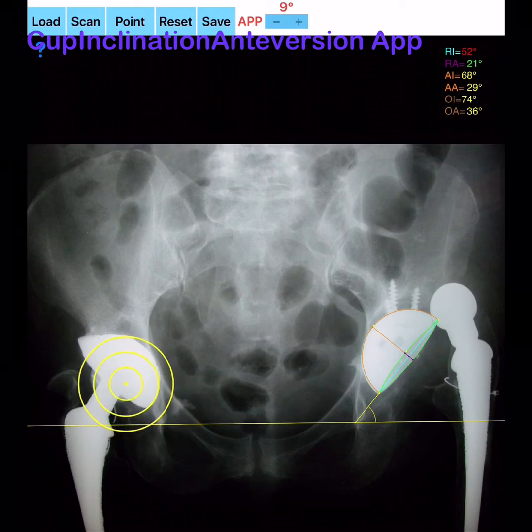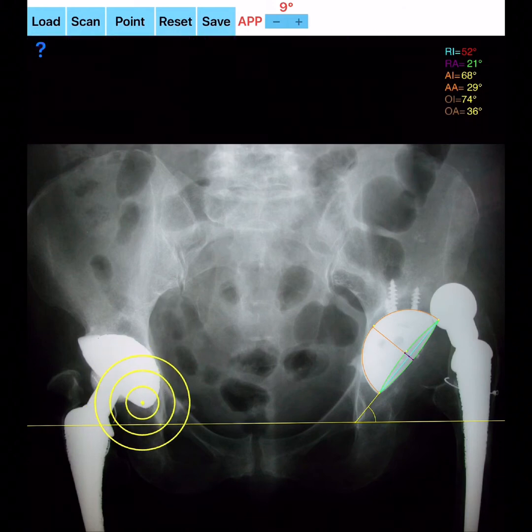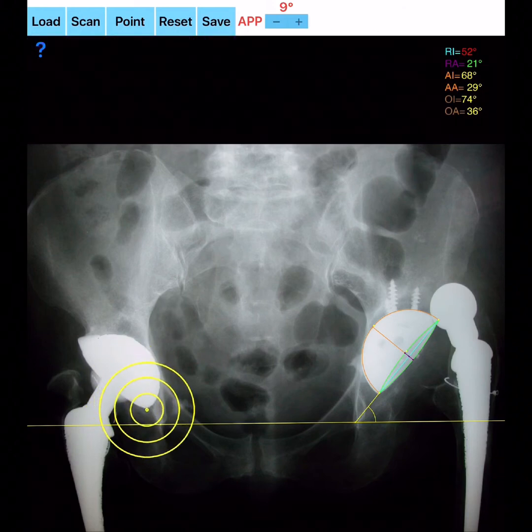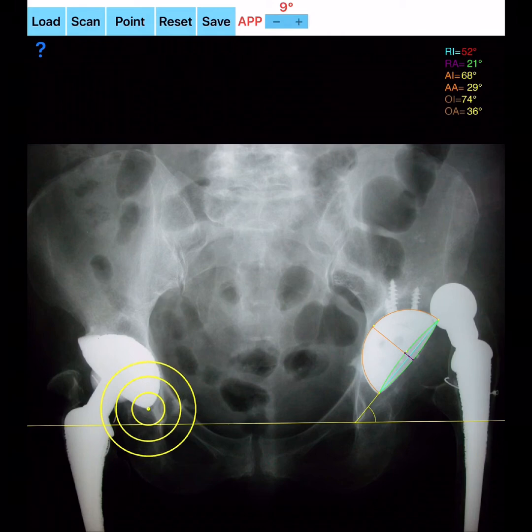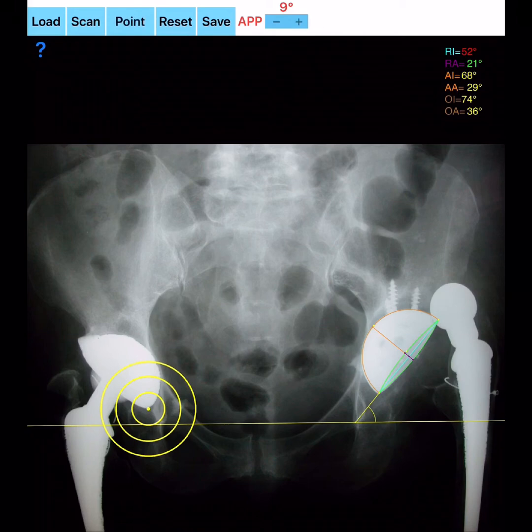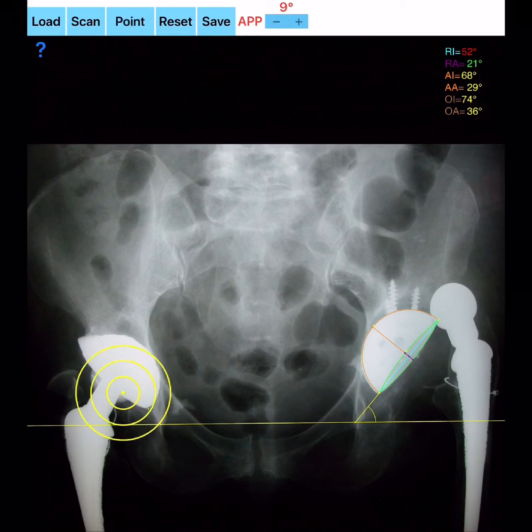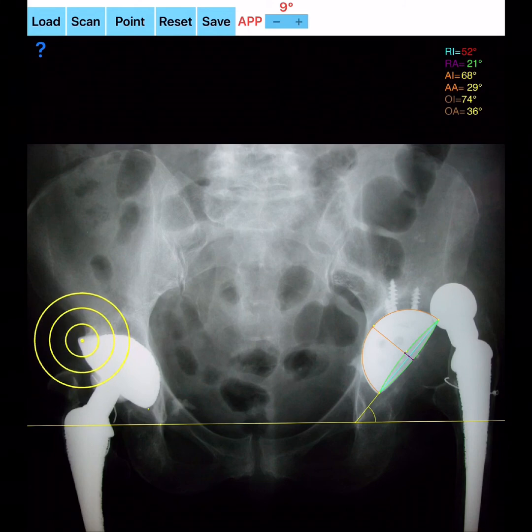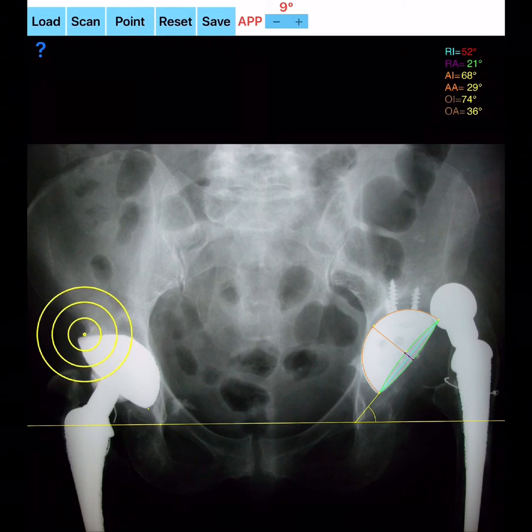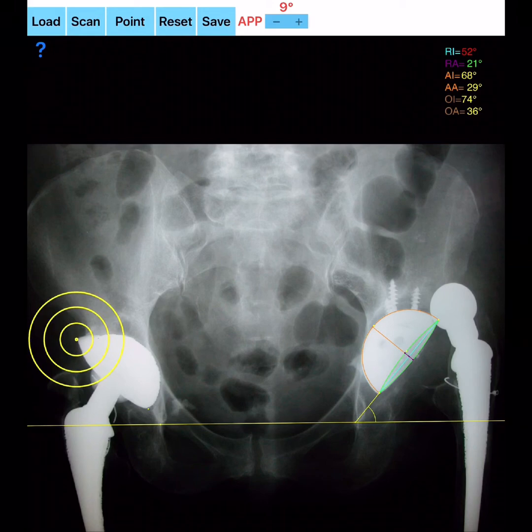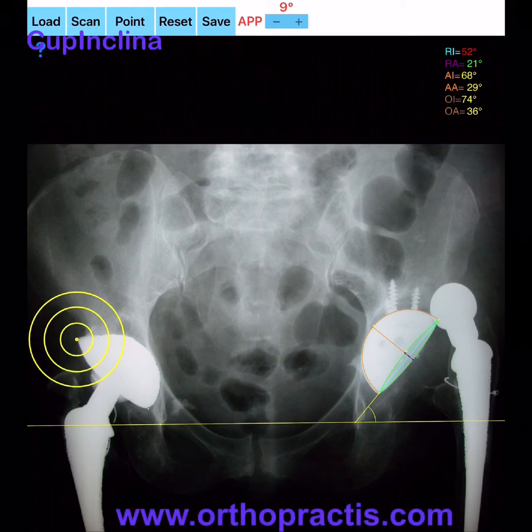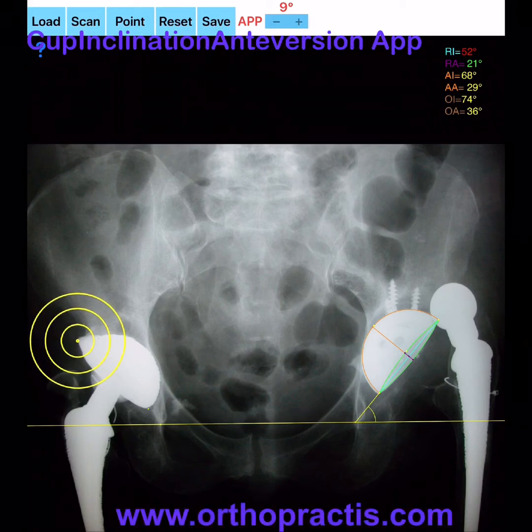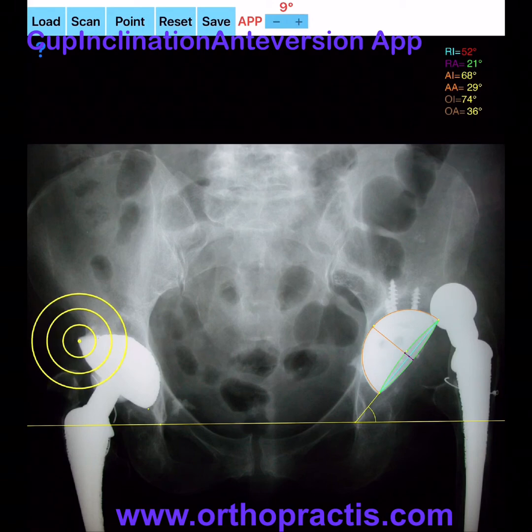In quick view, the reference points you have to choose sequentially and manually are shown in the following order: using the plus or minus button, set pelvic tilt measured by APP angle — if left blank, zero value is taken by default. Then mark T1 (right or left acetabular teardrop), T2 (left or right acetabular teardrop), C3 (most medial point of the right cup), C4 (most lateral point of the right cup), C5 (most caudal point of the right cup), C6 (cephalad point of the right cup). Without repeating the selection of teardrop points T1 and T2, you can proceed to the other side.